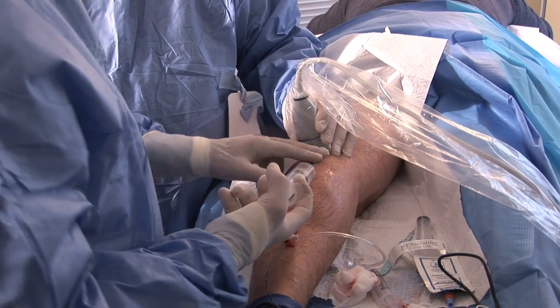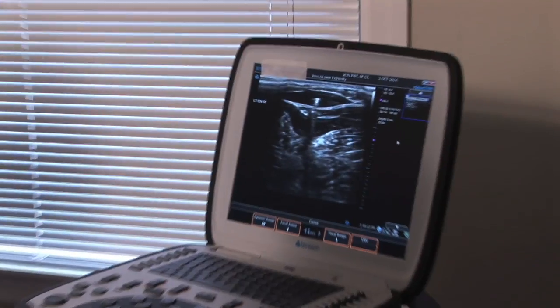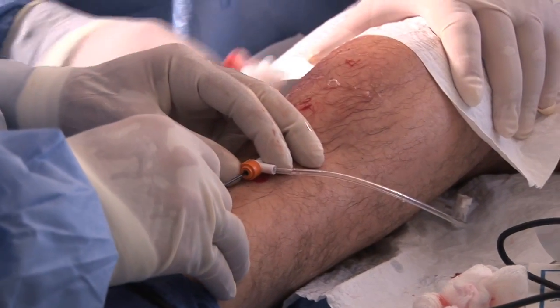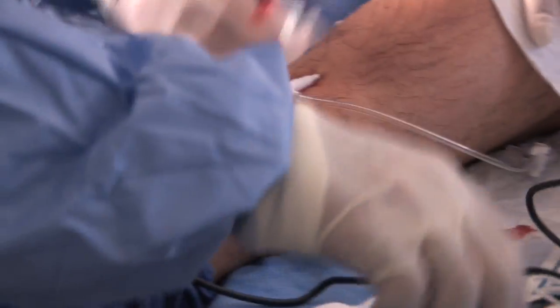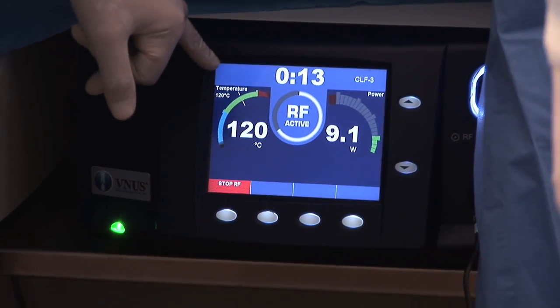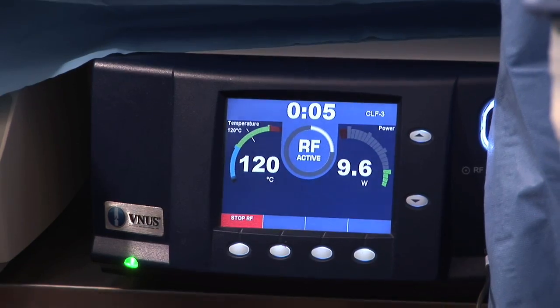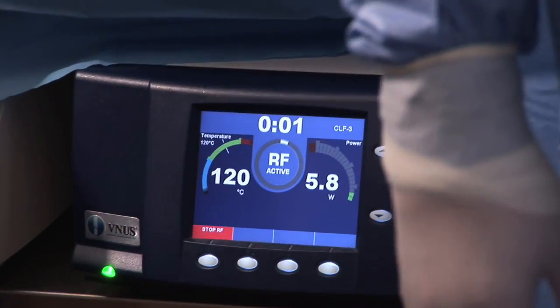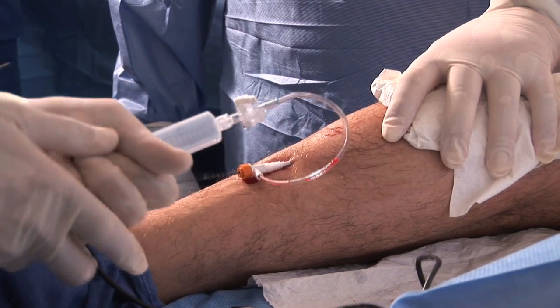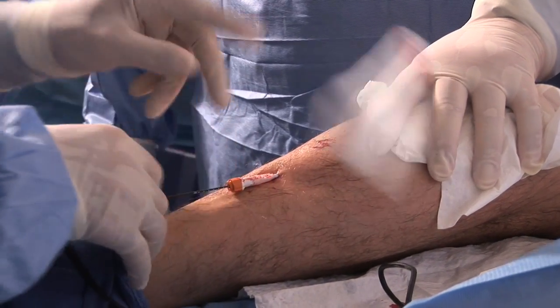Once that is completed, the generator is turned on. The temperature increases to 120 degrees Celsius and counts down for 15 seconds. It holds there for 15 seconds, ensuring that the section of the vein the catheter is in contact with is closed with thermal energy. We do that every three centimeters or every seven centimeters depending on the length of the fiber we use and the length of the vein. We do that all along the length of the vein and close the vein shut.